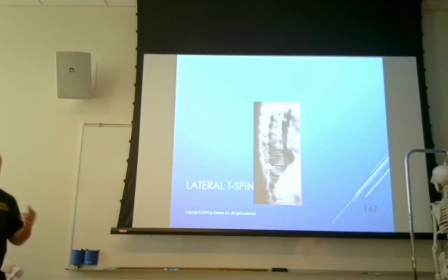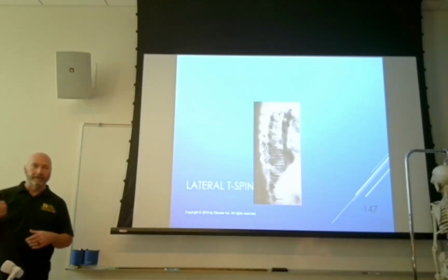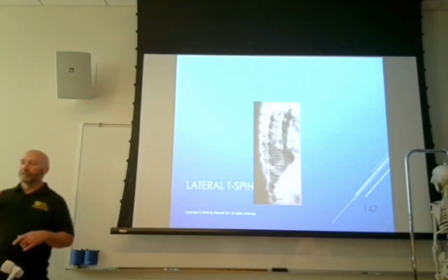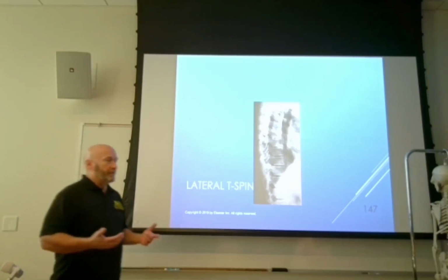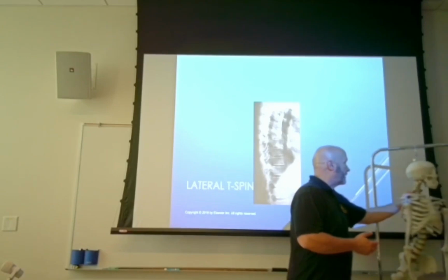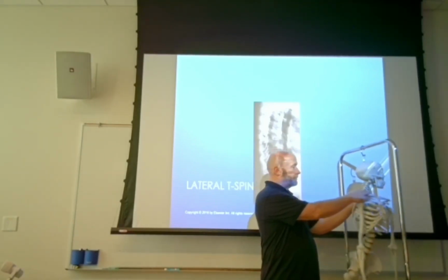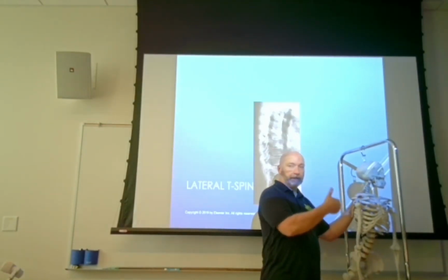So the test is going to ask you what you see and where you see it on each one of the anatomies that we're going to cover: T-spine, L-spine, and C-spine. So we saw the zygapophyseal joint on lateral on a C-spine, right? So it might ask you where you're going to see the intervertebral foramina, and that's going to be that hole right there, and that was a 45-degree oblique with cephalic central ray angulation with the patient AP, right?